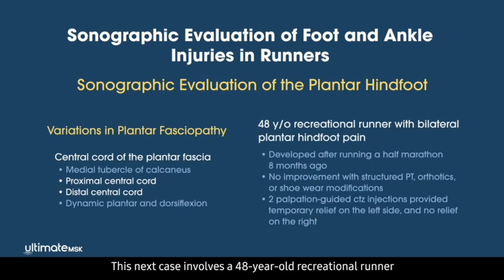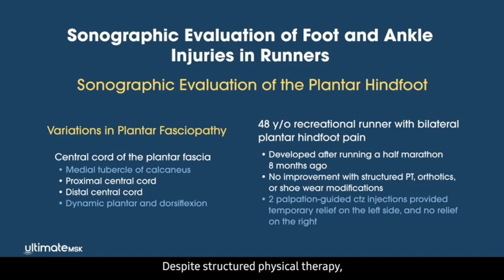This next case involves a 48-year-old recreational runner who developed bilateral plantar hindfoot pain after running a half marathon 8 months ago. Despite structured physical therapy, orthotics, and multiple changes in shoe wear, she continued to experience symptoms that limited her running. 2 palpation-guided corticosteroid injections resulted in temporary relief on the left side, but no relief on the right.